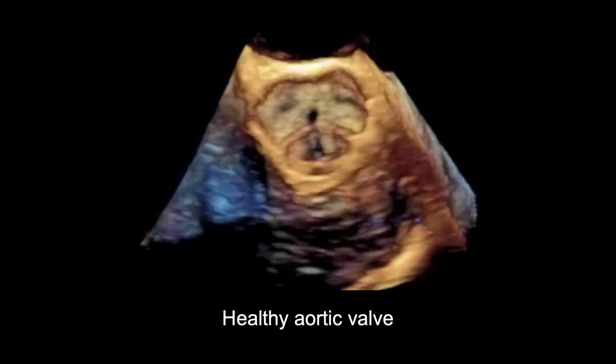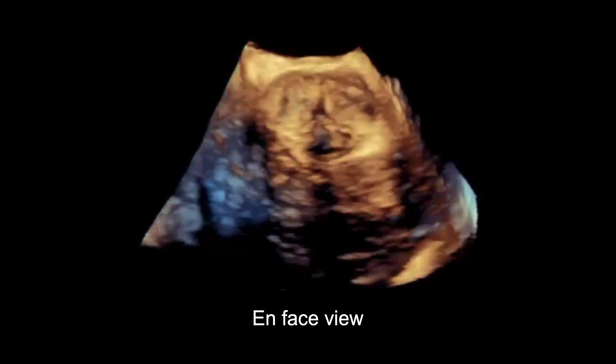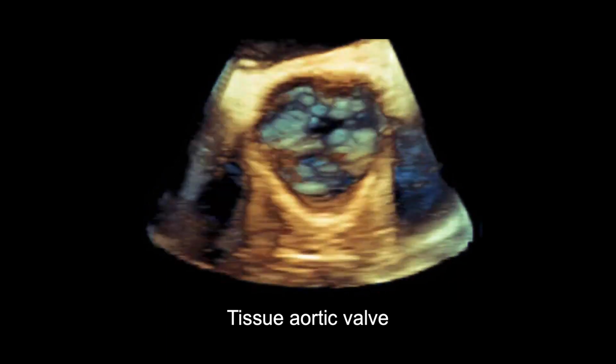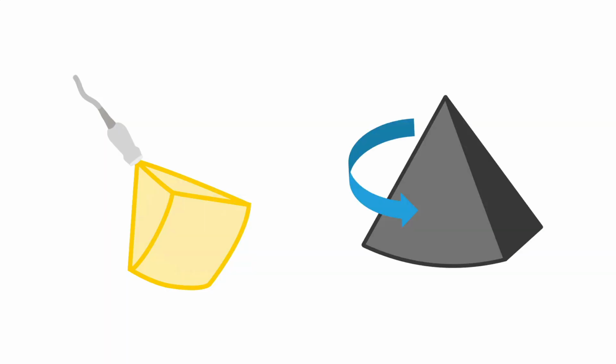This is a 3D echo image of a healthy aortic valve. You're seeing it en face as a surgeon would see it if they were operating. This is a 3D transesophageal echo of a replaced tissue aortic valve in the short axis. Remember that 3D echo also allows rotation of the image for a more detailed assessment.